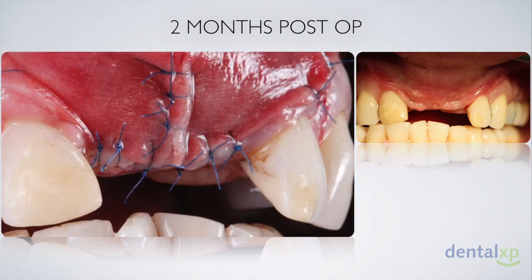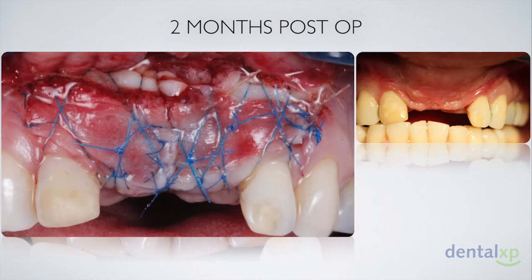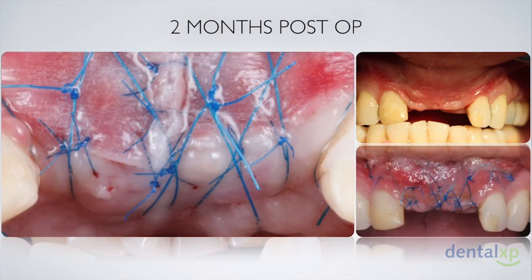This time we increased the width of the mucograft to compensate for any anticipated shrinkage we may have, as well as increasing our suture adaptation in order to decrease any micro movements that may compromise the wound healing and contribute to this shrinkage. And if we take a look, this is again the compressive sutures with a crestal view showing very intimate adaptation between the mucograft and the tissue. Also 2 weeks healing, showing a nice tissue blend of the area, and uneventful healing with minimal pain or discomfort.